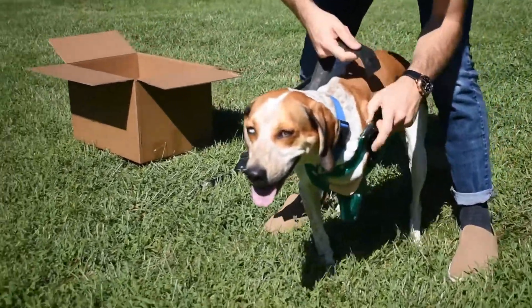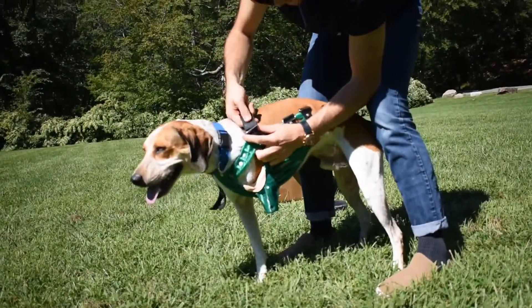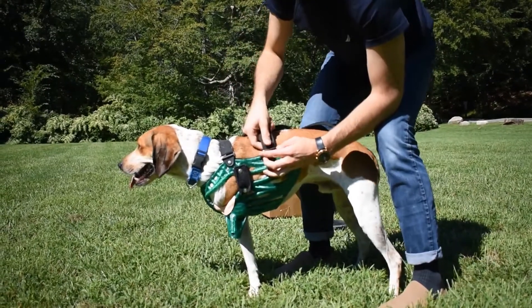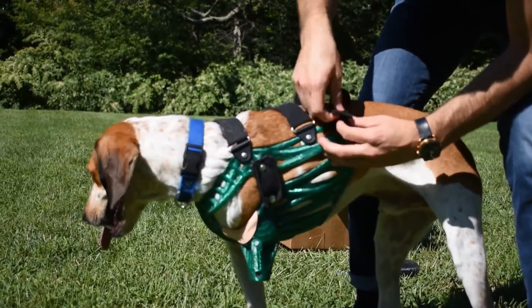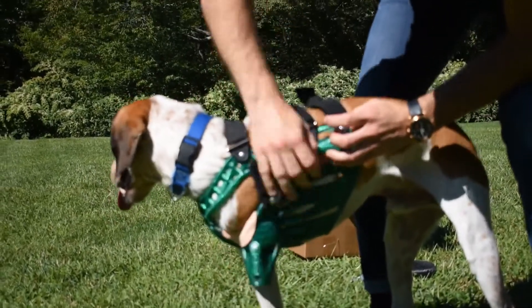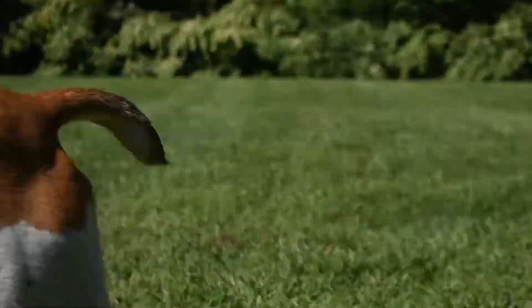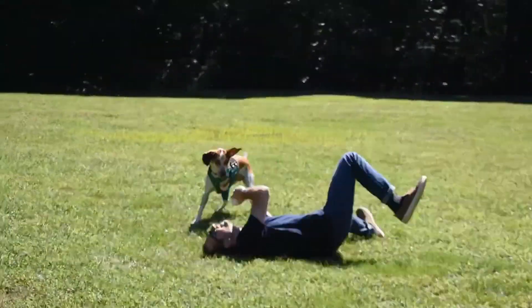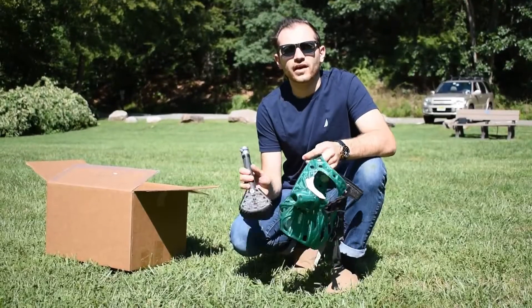We're going to have Jack hop in here — good boy! I'll bring our straps around. Now with the straps, you want the middle one to be a little bit tighter than the front and the back. The reason for this is it acts as a hinge, so the jacket can pivot a little bit on that center strap. Once those are tightened down, we're going to let Jack run off and get comfortable.